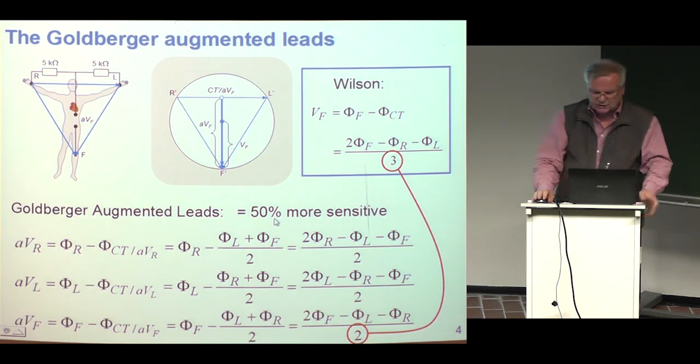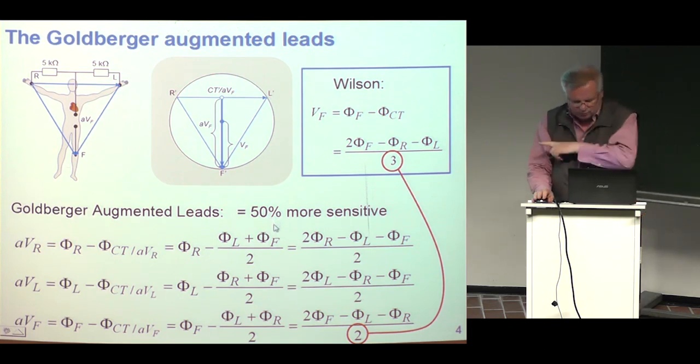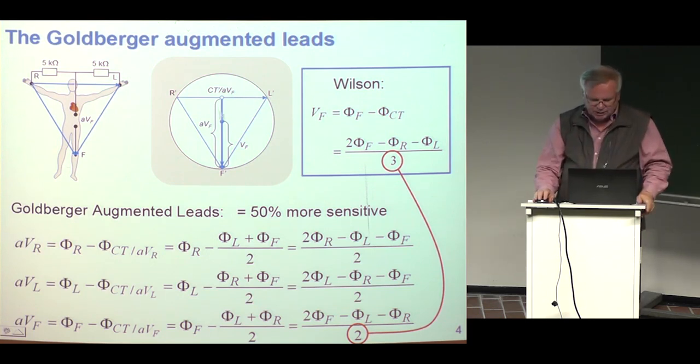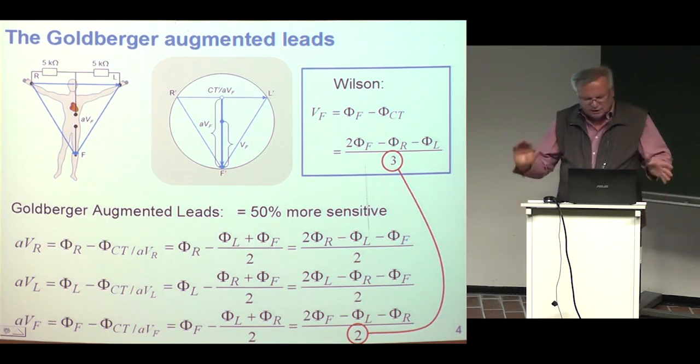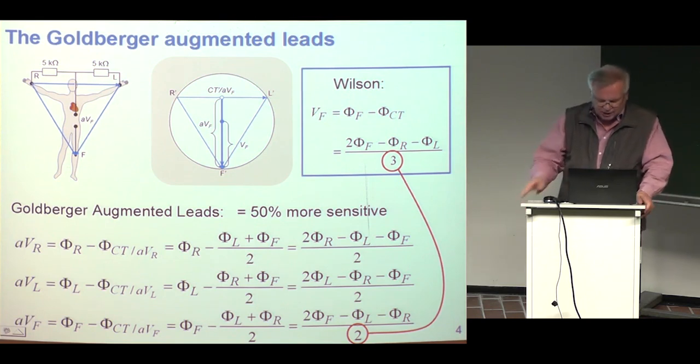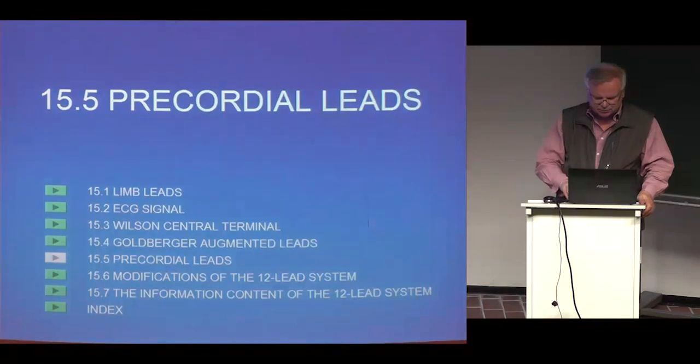That is the point. The signal is exactly the same form, because the lead vector is in the same direction, but the lead vector is 50% longer, so the signal is 50% higher in amplitude. So this is a smart, but not so very complicated, invention of Mr. Goldberger, and these are the Goldberger augmented leads, which are the development of the Wilson leads.